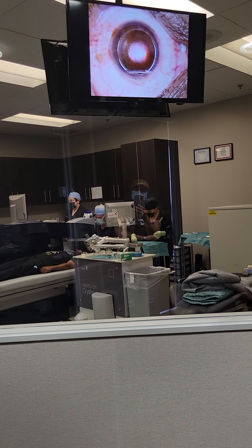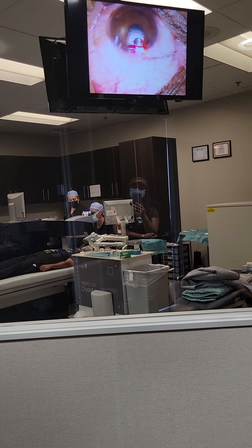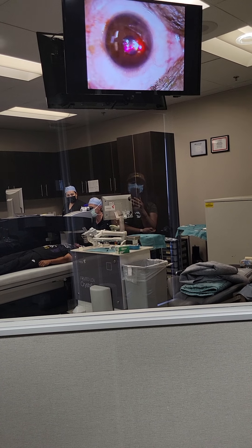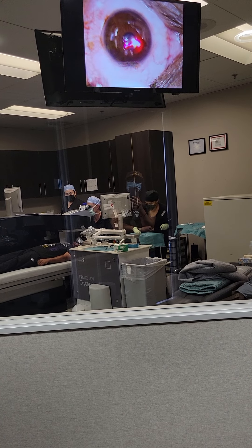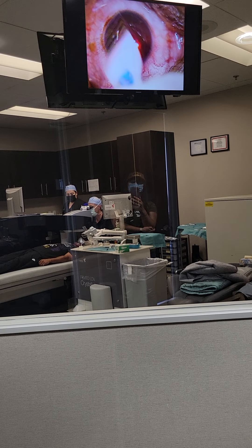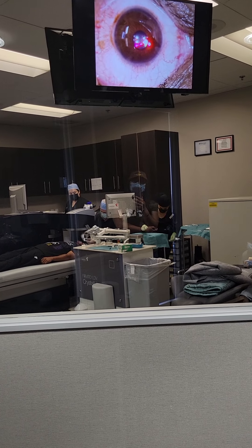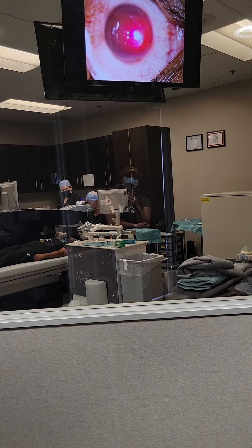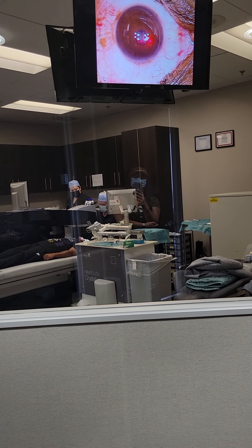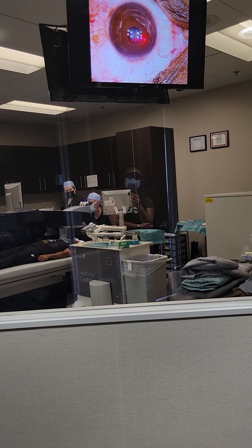Which one way? Can I see a lady over there? Is there a red one? Can I go over there to see? Did they just put glue? I don't know what they put. They have a cleanse. Oh, she'll put that in there. I don't think I'll be able to walk in. Oh, there's a freckle that got left. Oh yeah, it's further away from his eye. Does that freckle miss the vision? No.